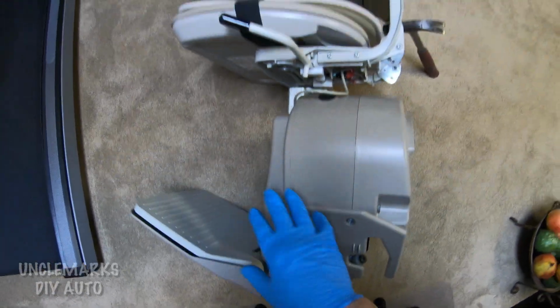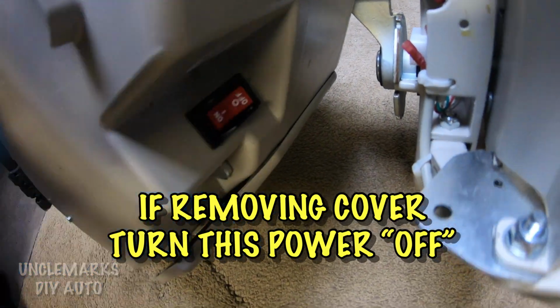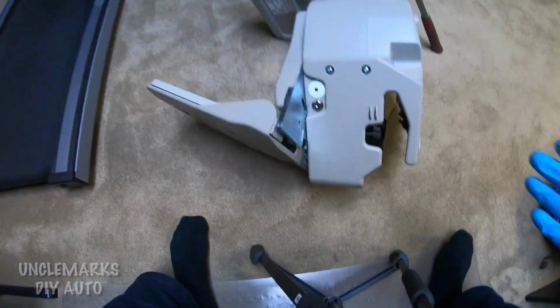So this is actually, you can see where your foot is. This is the back side of it. Should be an on-off switch somewhere. I believe this is almost like a little circuit breaker as well, so it may have tripped. So you can feel around and see. It says off and on. Flip that, see if that works.